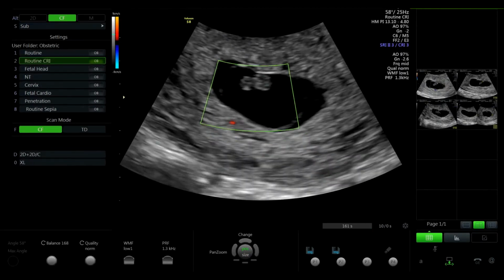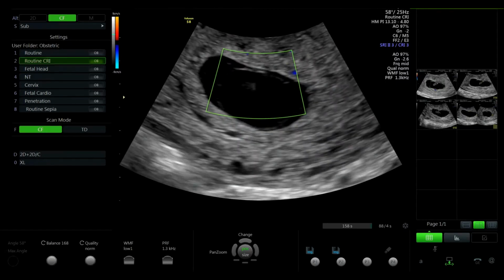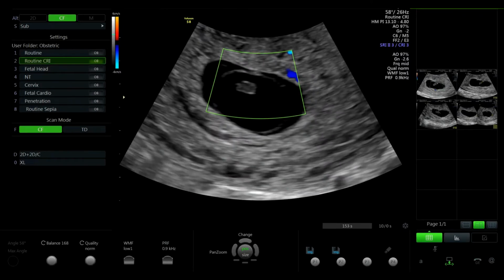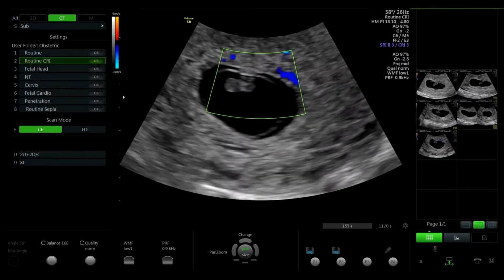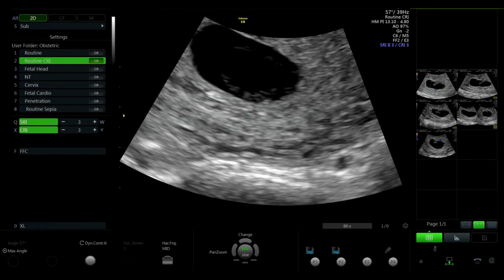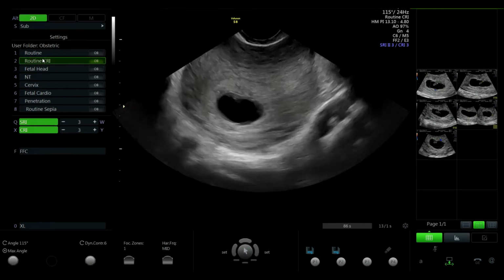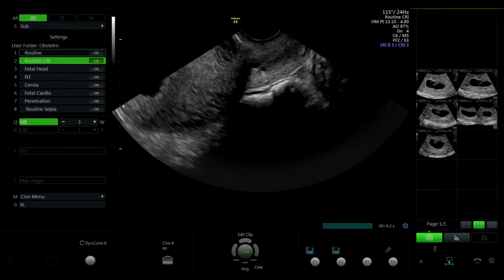The sonographer must explain that they are sorry they cannot be conclusive at this scan. They must then explain they can see the pregnancy sac with a yolk sac, which confirms an intrauterine pregnancy. However, they cannot see a baby, or they can see a baby and tell them the measurements, but unfortunately no heartbeat. There are 2 possibilities for this inconclusive scan.